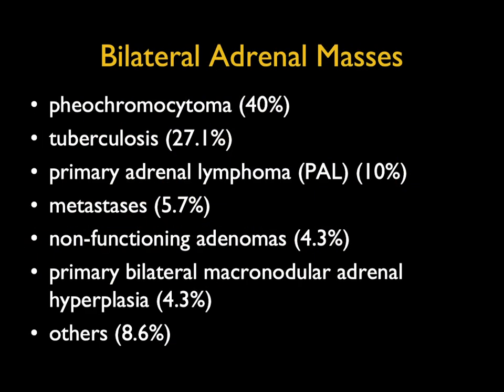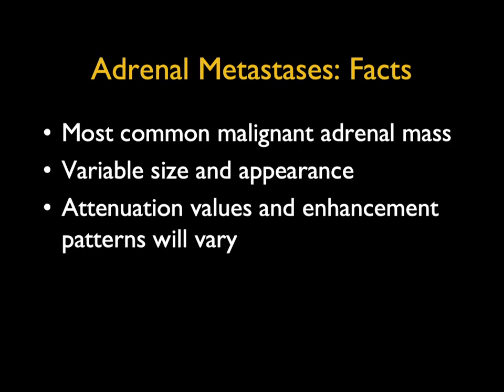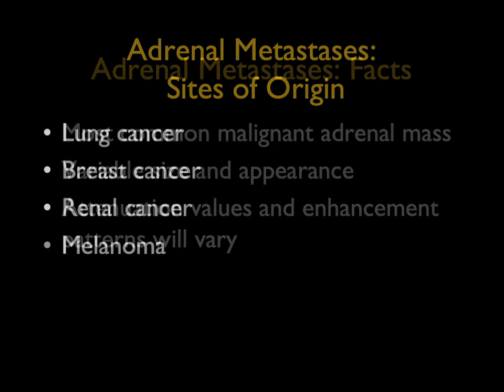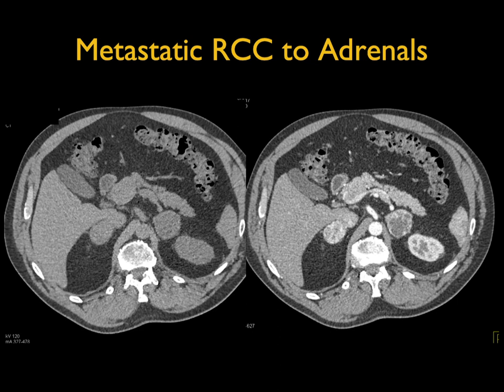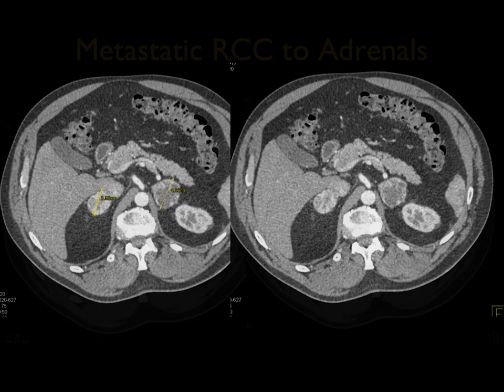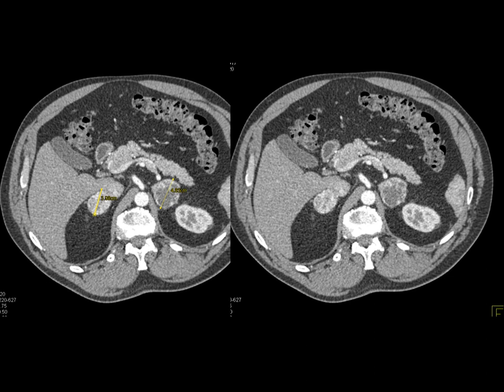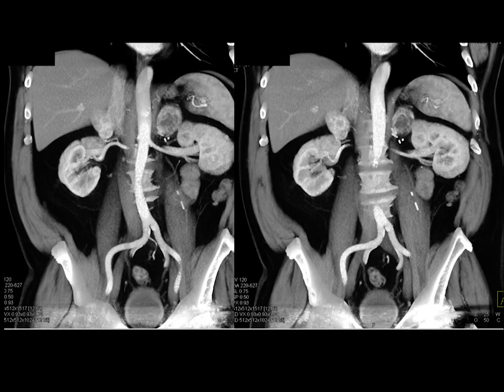When thinking about bilateral adrenal masses, metastasis is the classic — the most common malignant adrenal tumor, with variable size and appearance and attenuation values often depending on the primary tumor. The most common sites of mets are lung, breast, kidney, and melanoma. Here's an example: bilateral adrenal masses on non-contrast and contrast imaging that both enhance. The patient was missing the right kidney and had known clear cell renal cell carcinoma — this is bilateral adrenal metastasis.